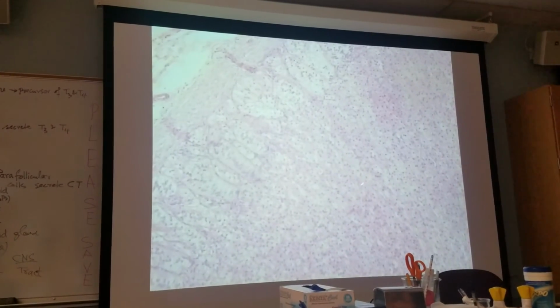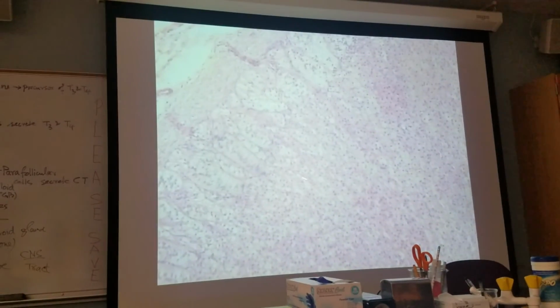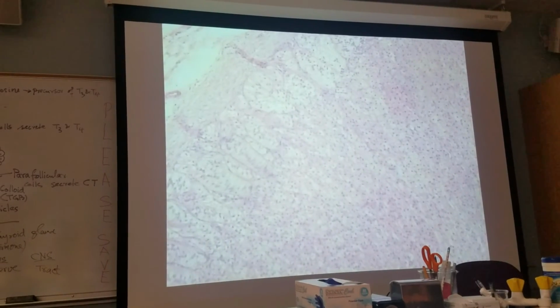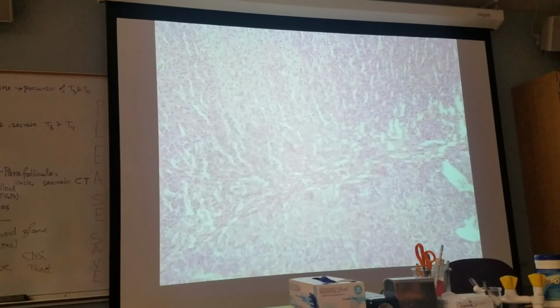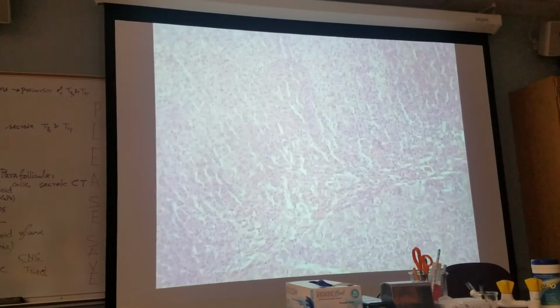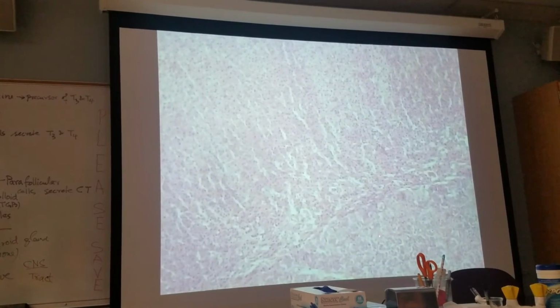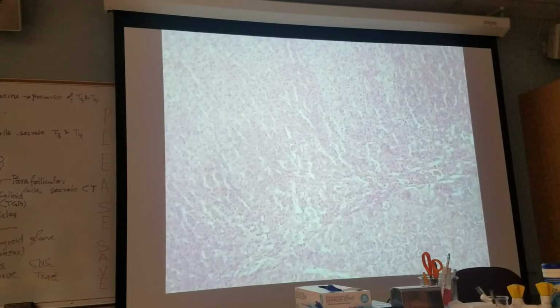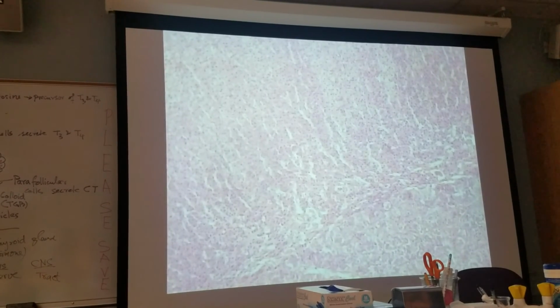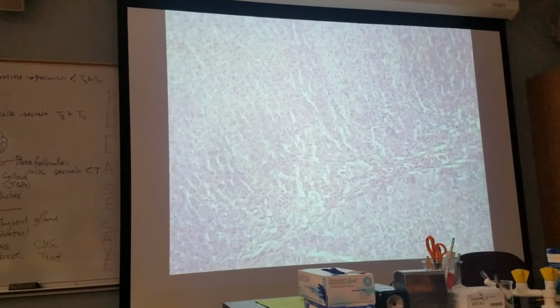So can you distinguish zona glomerulosa and zona fasciculata? When they are put together, definitely. Or when you see, right, here, a little bit of zona fasciculata, zona reticularis, here is the adrenal medulla. I don't expect you to learn in one day. You have to look at it many more times. Okay? Practice makes perfect.